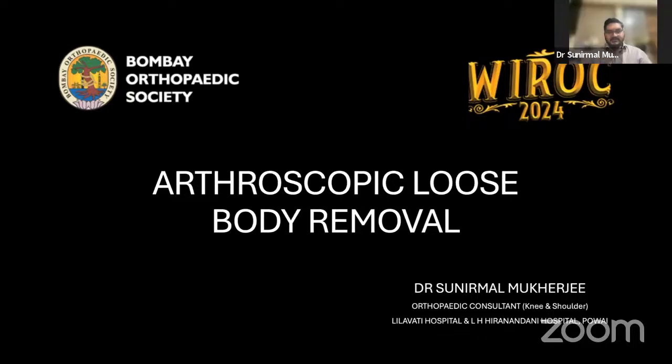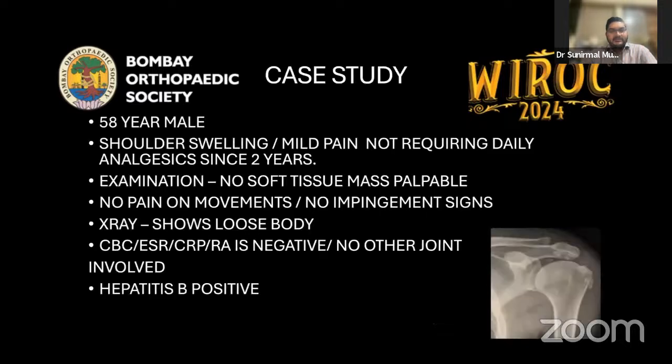Yes, sir. I'm extremely grateful for this opportunity to speak today. So my topic is arthroscopic loose body removal. I would like to start with a case study. A 58-year-old male came with a shoulder swelling and very mild pain, not requiring painkillers, and it has been there for a couple of years.